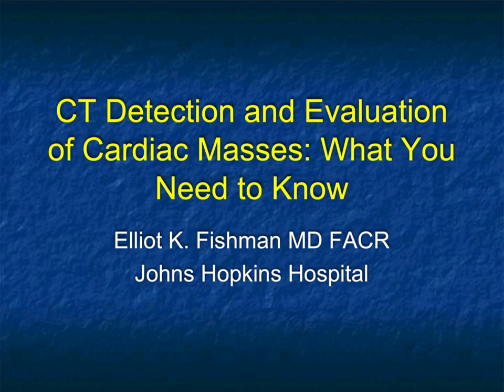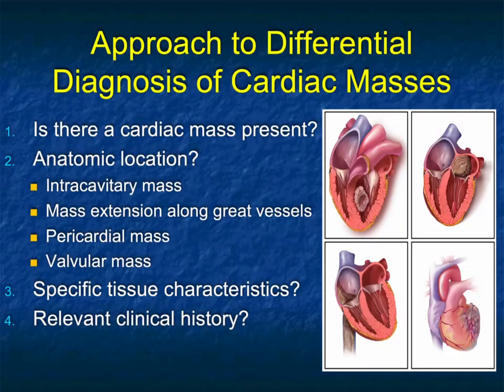This will be on the CT detection and evaluation of cardiac masses, what you need to know. So let's get started. I think one way of thinking about cardiac masses is really a very organized approach.